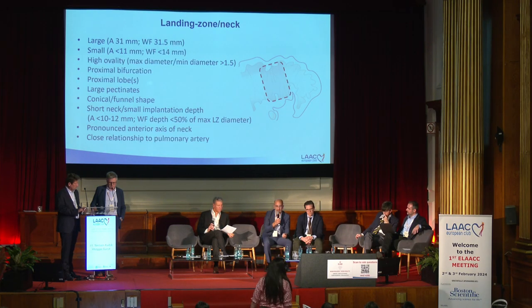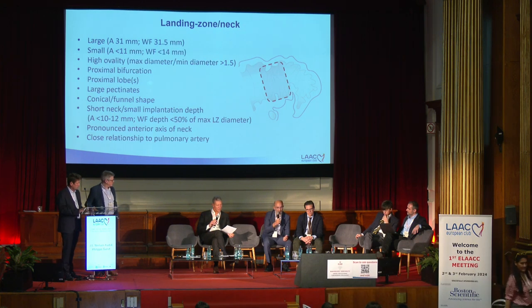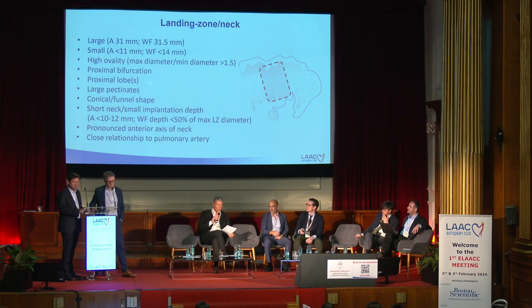Who is going to look at the distance between the pulmonary artery and the appendage, and if you put that in the classification as a single item, you will not say it's complex. Actually, there is a risk, like many other factors, but it will not influence your implantation technique. Yes, they are two different aspects. One is the risk of a complication. The other is the technical approach to the procedure.